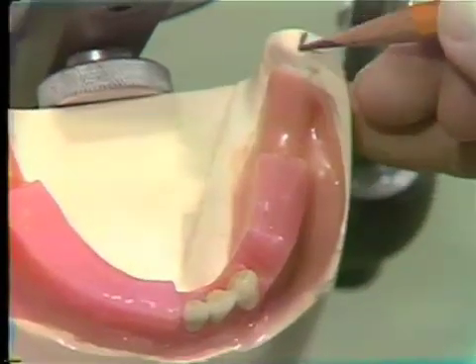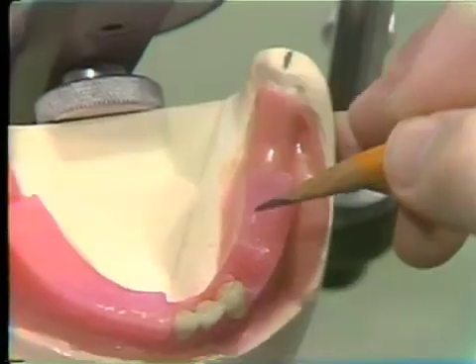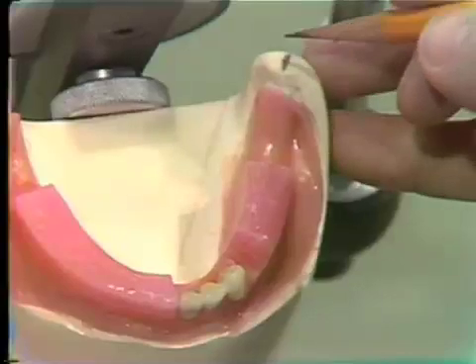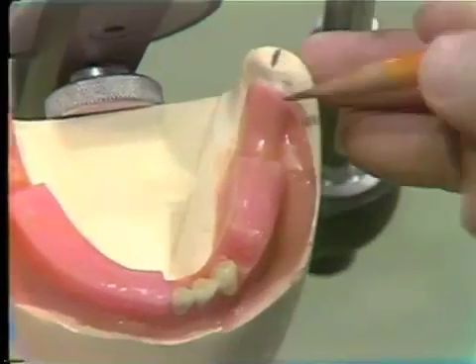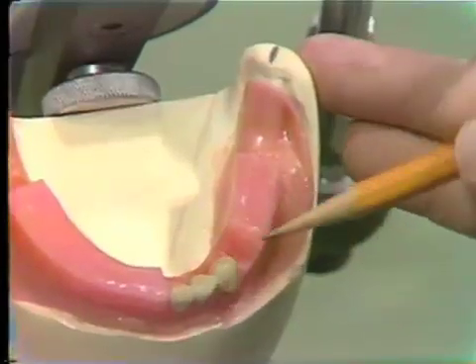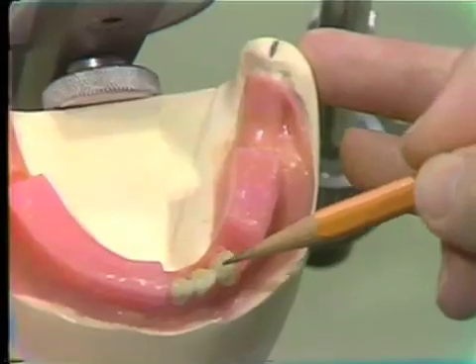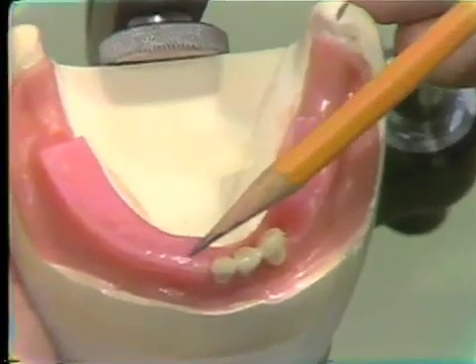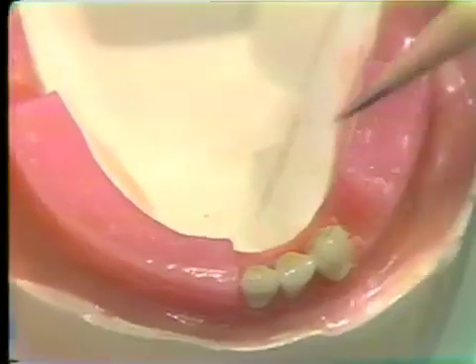And you see the mark on the back of the cast here. What I've done when the base plate was off, so I've made a mark all the way along the top of the ridge, and that will be a guide to the central fossa of the lower posterior teeth when we set the posterior teeth. And that will be demonstrated separately. But at this time, the central incisor, the lateral incisor, and the medial portion of the incisal edge of the cuspid tooth are in alignment in the contour, the configuration of the symmetry of the other side of the wax rim.